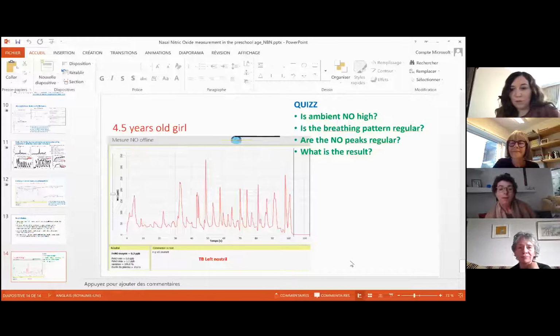You carry on. Okay, so this is just a quiz. I just have 4 questions. First, is ambient NO high? Second, is the breathing pattern regular? Third, are the NO peaks regular? And then finally, which result would you give to the person who referred the child to you? And so I don't know how we deal with that. Just take a thought, and we'll discuss this after.